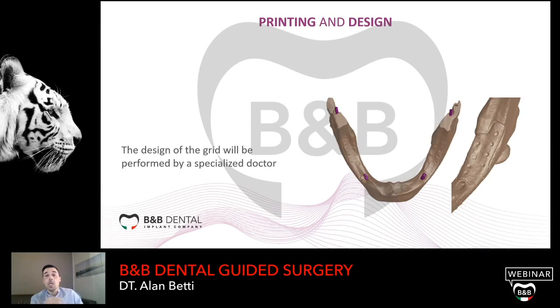The design of the grid will be performed by a specialized doctor. If you want, you can design your Juxtagrid, it is not a problem, but if you want, we have some specialized doctors that can design the path of the Juxtagrid.